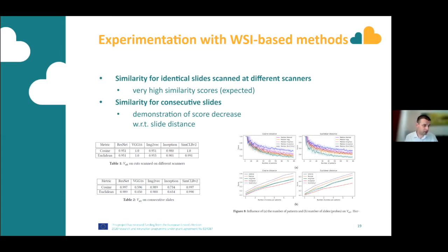showing the linking risks that are related to the sharing of this imaging, and not only sharing the same images, which are basically acting as a fingerprint, so that something that appears in different data sets, you can consider a perfect linkage across the data sets.